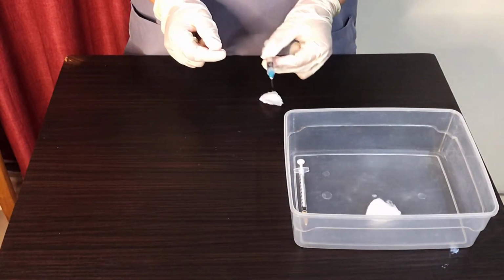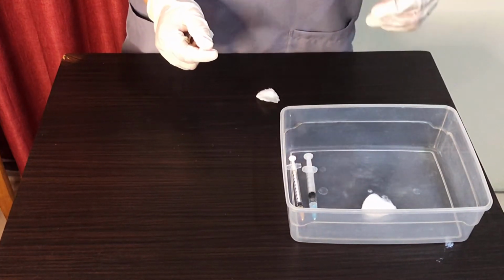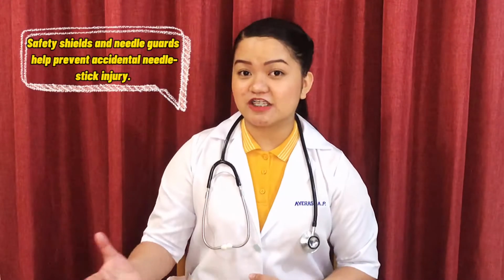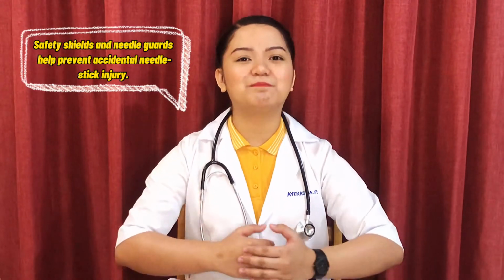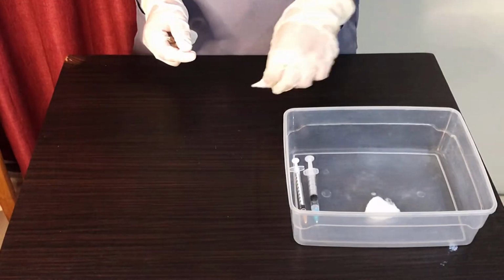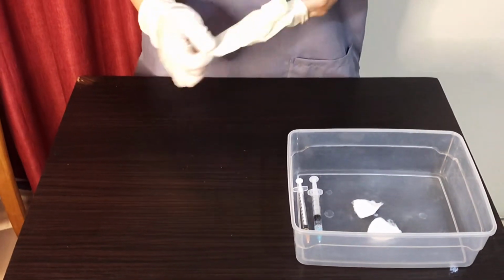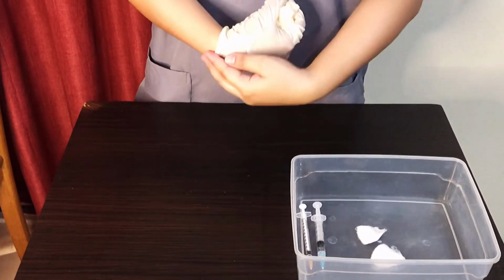And then discard the syringe and needle into an appropriate receptacle. Safety shields and needle guards help prevent accidental needle stick injury. And next, dispose of the supplies used and remove your gloves.